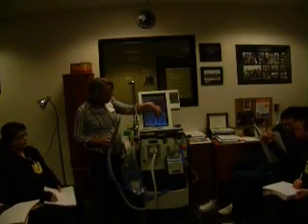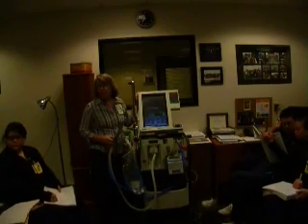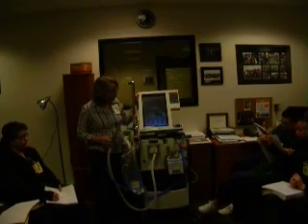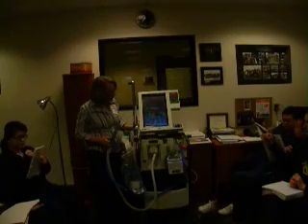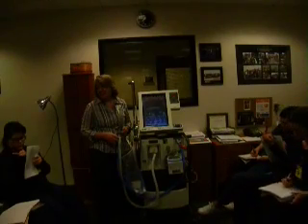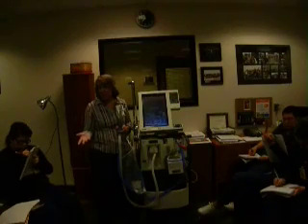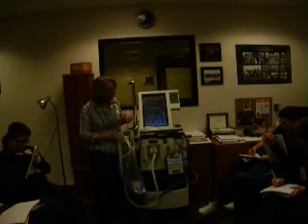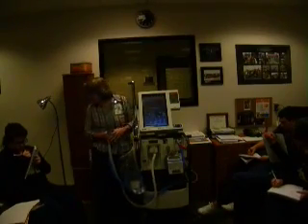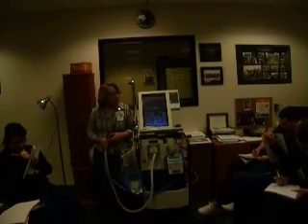So then we have, no, 2.0 above and 2.0 below minute ventilation from what your patient's averaging, which will be over here on the left. So then you have mandatory tidal volume and spontaneous tidal volume. Mandatory is the machine breaths. Spontaneous is if your patient's taking spontaneous breaths. It may or may not apply. But typically it's 200 above and 200 below. So if your tidal volume is averaging 500, you put the high at 700 and the low at 300.